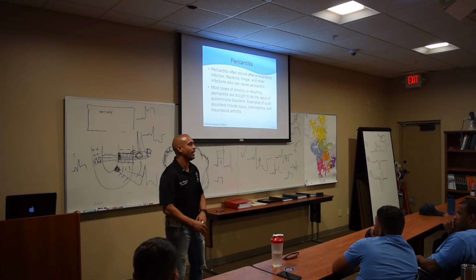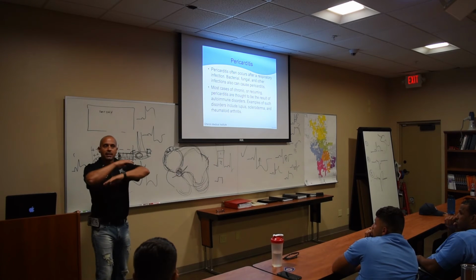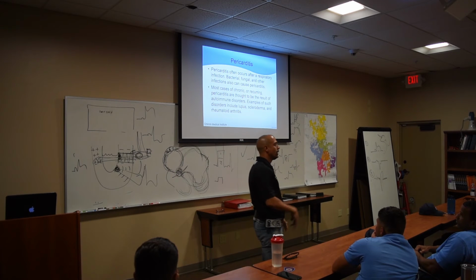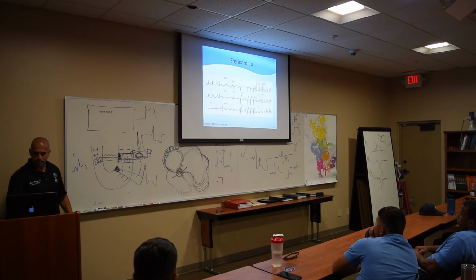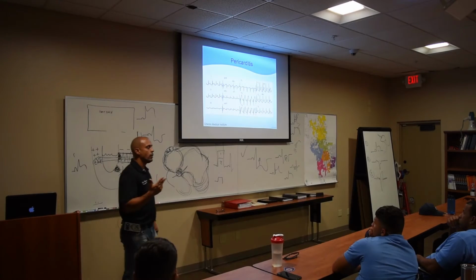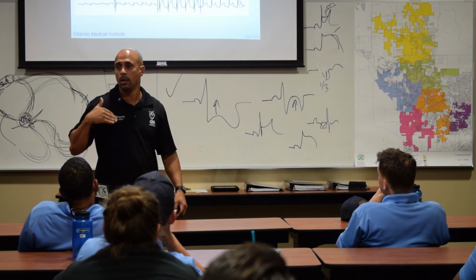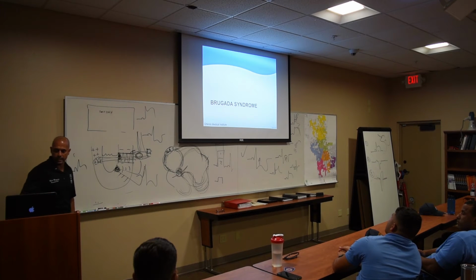Because guess what the ST elevation is? All over the place. When I see ST elevation all over the place, I say, hey, you've been sick with a respiratory infection. Oh my God, I had the flu. How do you know? Pericarditis is showing me. The 12 lead is showing me. Look at this right here. You got to say, that ain't good. Yeah, because you got pericarditis. But you know what you're not going to have? Reciprocal changes. And a lot of your ST segments are concave too, just like early repol. They're concave. They're not convex. So you know you got pericarditis.